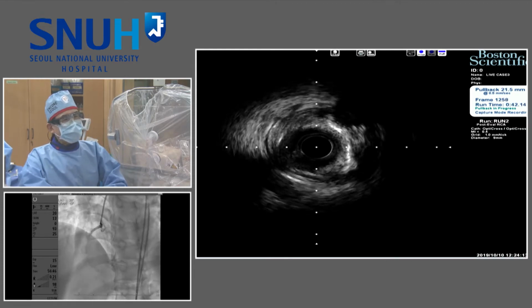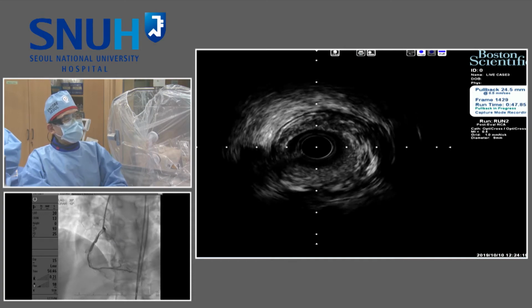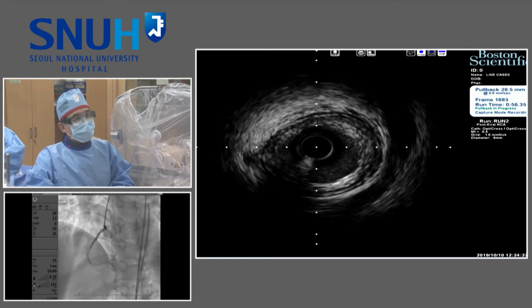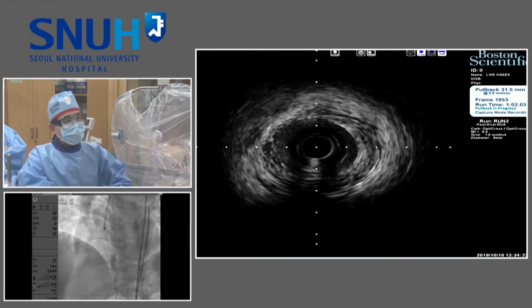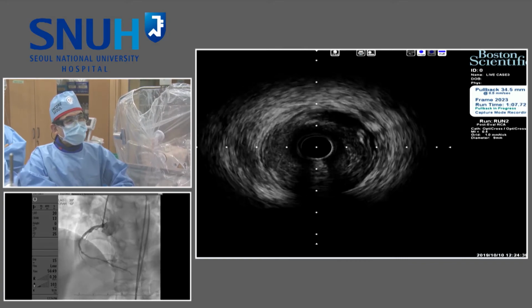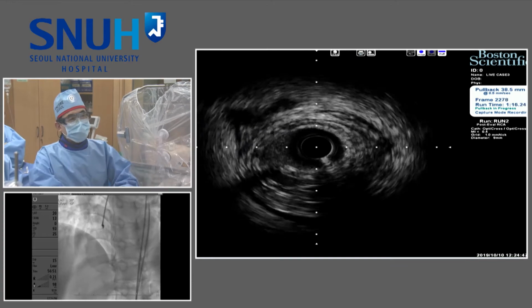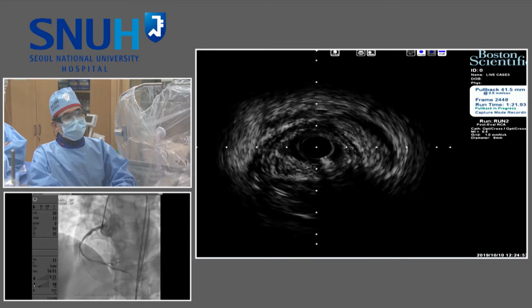I mean, the artery does not always read the book and the IVUS. There is a huge plaque there, which is pretty old and calcified. You don't want to over-dilate it and finish a beautiful case you've done so far with a catastrophe. So don't be greedy. I would put something much smaller. If you take a 2.5, you can enlarge it to 3.5, right? So start with a 2.5 by 15-something millimeter. Look at it, give nitro, do IVUS, whatever you want, and then you can post-dilate and do a trumpeting to the proximal part.